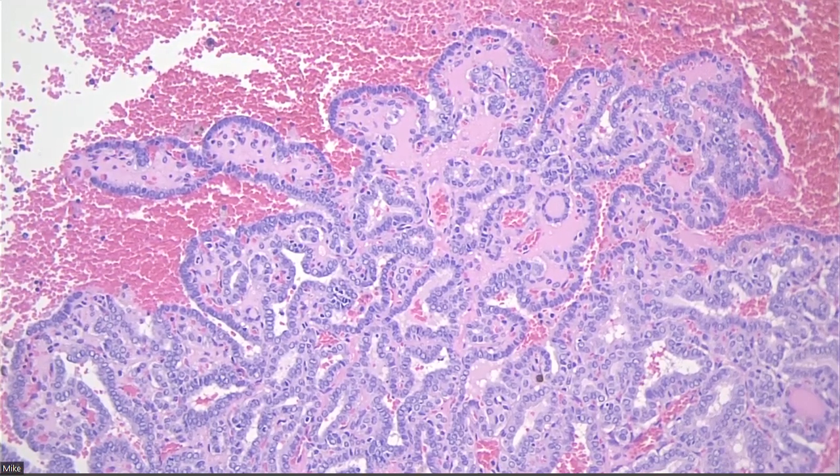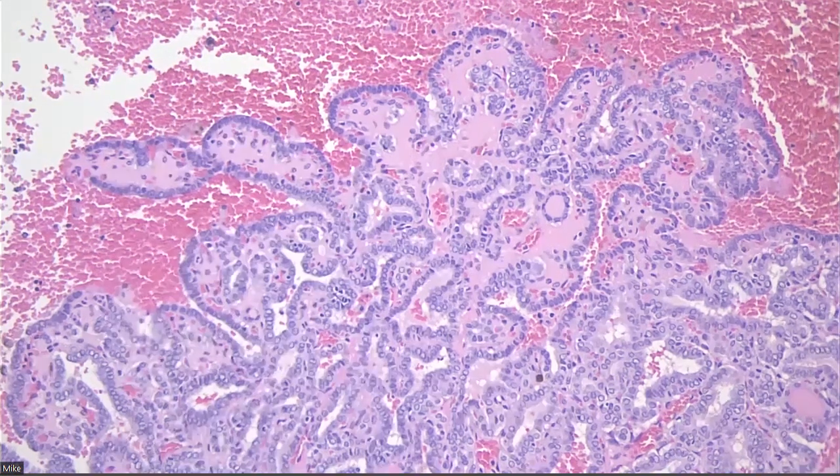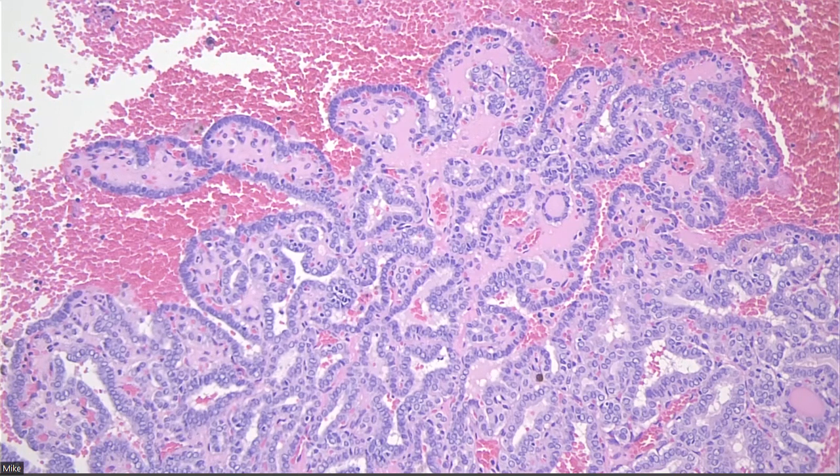But if they're really branching, the closer I get, the tighter they are with thin cores and complex branching, and then increasing dense eosinophilic cytoplasm, all those things start to add up to, okay, this is a little more real. And so that's why the 1% papillae versus the 0% papillae question is still under debate.